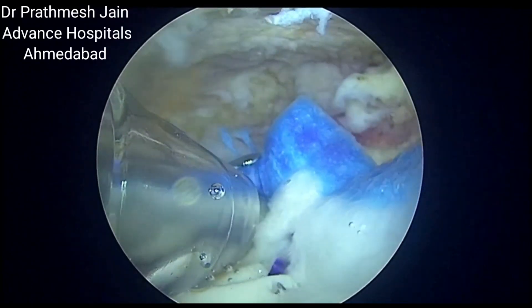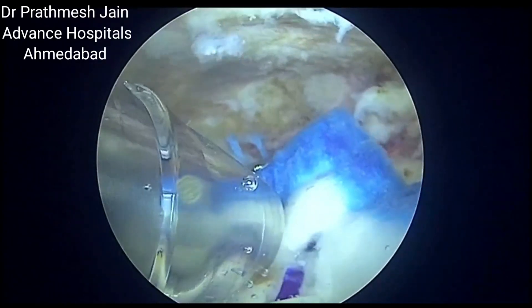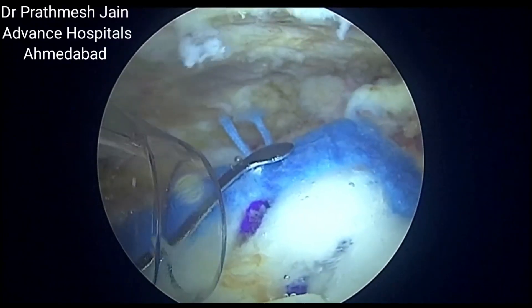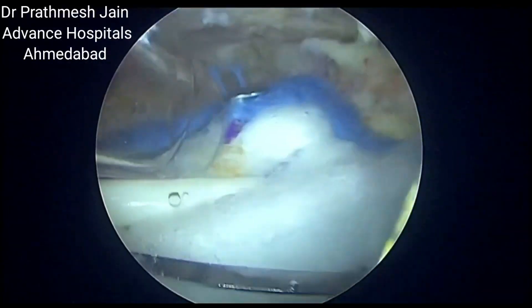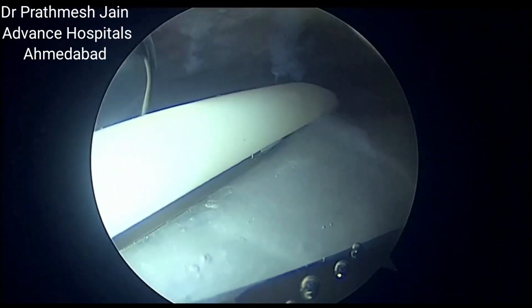You can put one, two, three, up to eight tendon anchors for good fixation of the tendon. You need to be sure that the position of the tendon anchors is maintained.